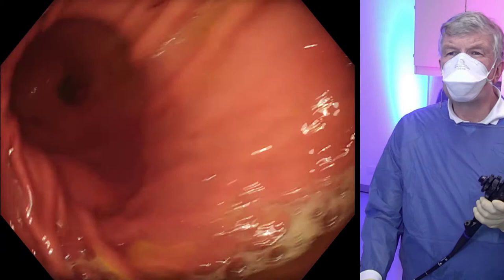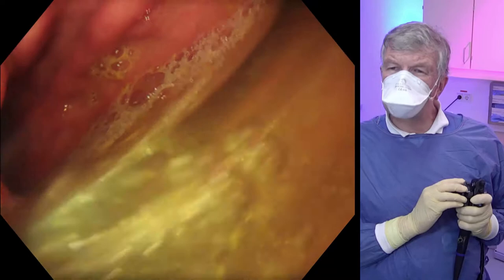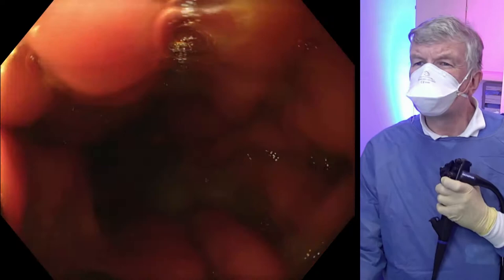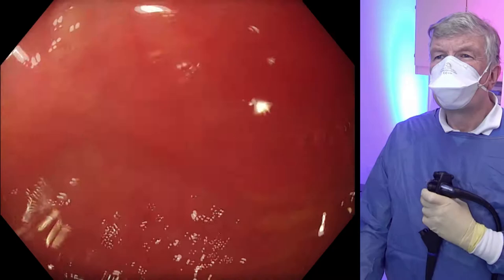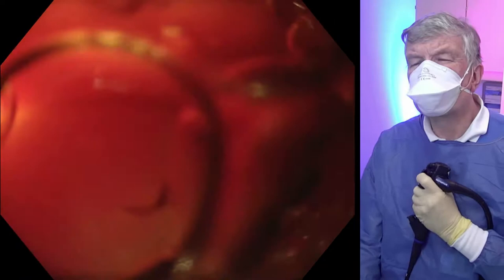Here you see how the stomach is visualized with quite a few residual fluid. This is a gastric pull-up after esophagectomy. We now pull back to the anastomosis with some clips and inflammatory changes with superficial ulcers due to reflux, and we go back into the antrum which makes a curve, and the pylorus is up here.